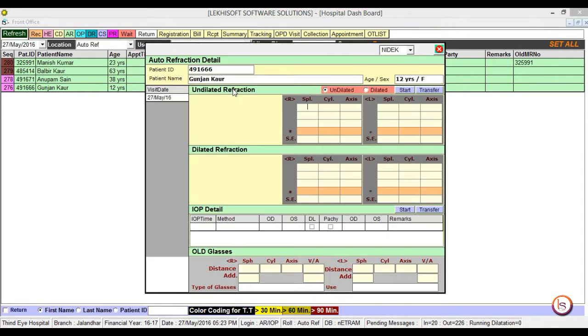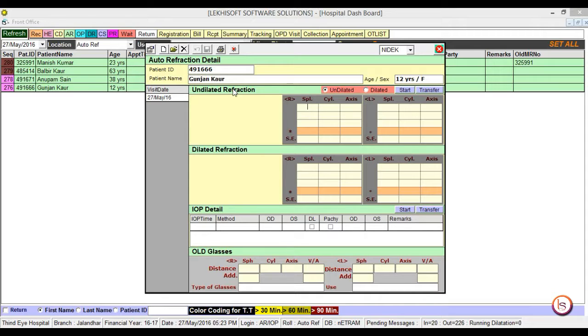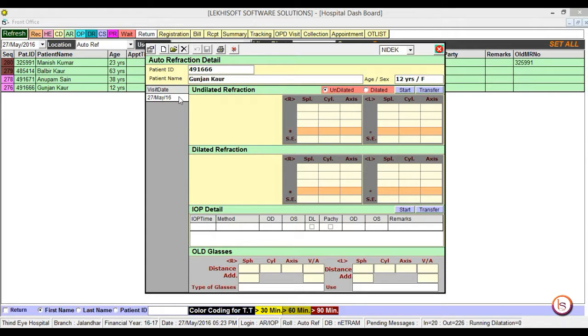Here you can see all the details, how many times the patient has visited. The white color represents no workup has been done, and green color represents that the workup has been completed.